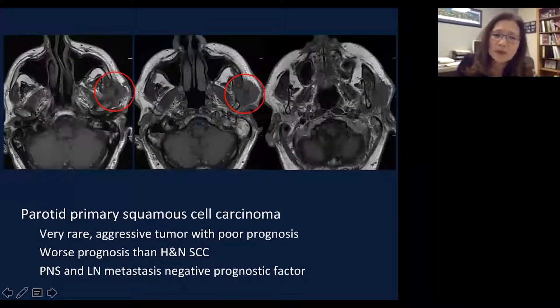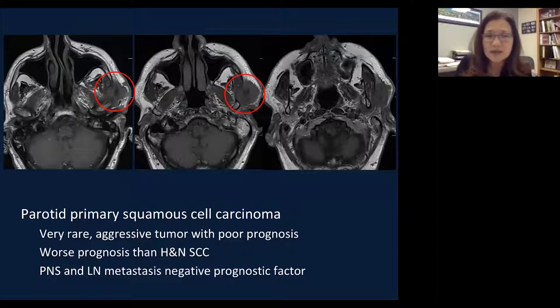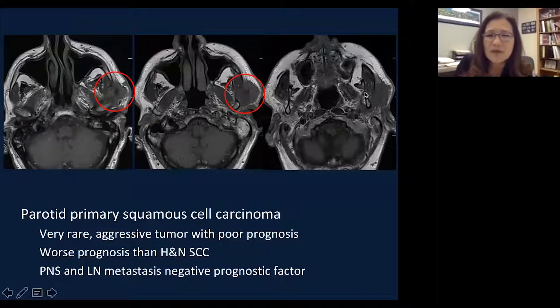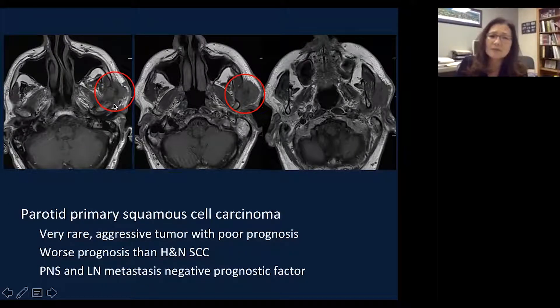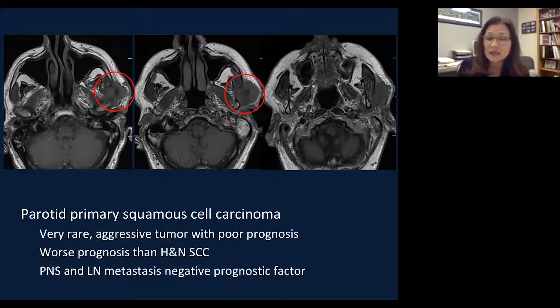That finding is indicative of perineural spread of adenoid cystic carcinoma arising from the parotid gland. This next case is an unusual pathology — primary squamous cell carcinoma of the parotid gland. On the T1-weighted axial image, you can see the mass infiltrating the muscles of mastication. There is also cutaneous extension, which represents dermal metastasis. These are very aggressive imaging features, almost involving the temporomandibular joint. Primary parotid squamous cell carcinoma is very rare, reported at 1% or less, but it does occur and carries the worst prognosis.